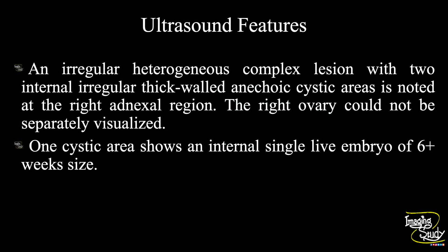In summary, an irregular heterogeneous complex lesion with two internal cystic areas is noted at the right adnexal region. The right ovary could not be separately visualized. One cystic area shows an internal single live embryo of six-plus weeks size, indicating a right adnexal live ectopic pregnancy. The other cystic area was the corpus luteal cyst.